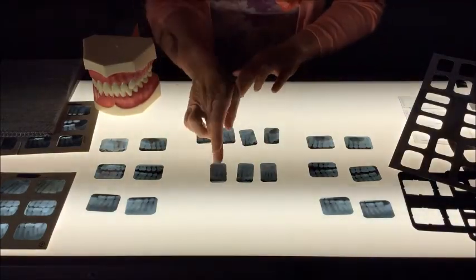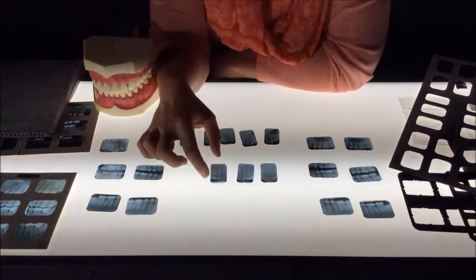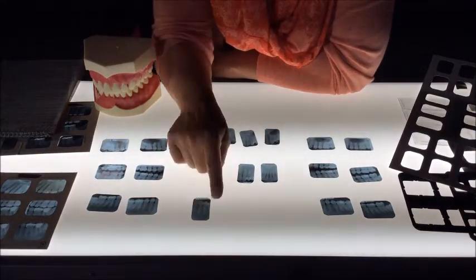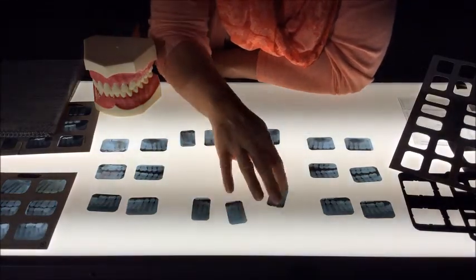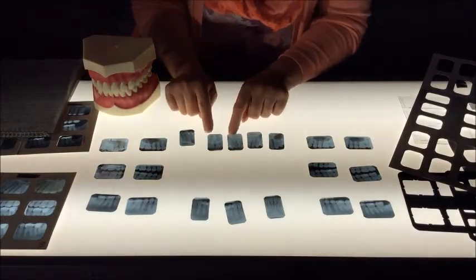And again, our mandible is thick bone. So like I said to you, orientate them so that the roots of the mandible are pointing down, and then you want to have the roots of the maxilla pointing up.